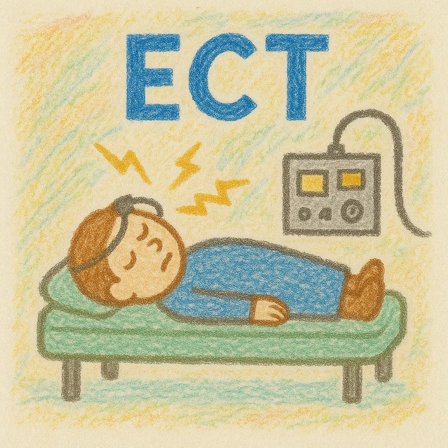So this is basically, if you look at a baseline recording of the EEG, so you let the EEG record what the baseline activity of the brain is while they're under anesthesia, but before we've induced a seizure, you're going to see some random noise, some random activity, whatever the baseline activity of the brain is. It's not going to be very symmetrical. It's not going to be rhythmic typically.